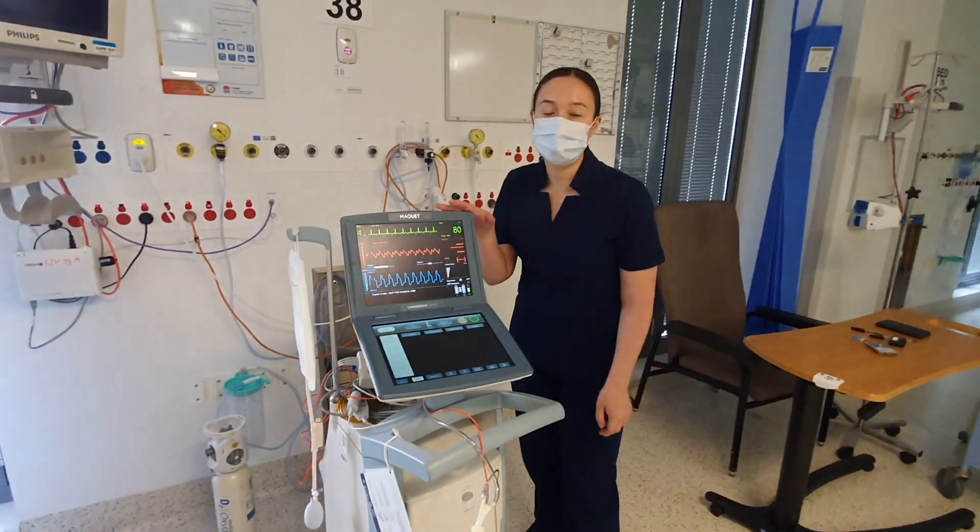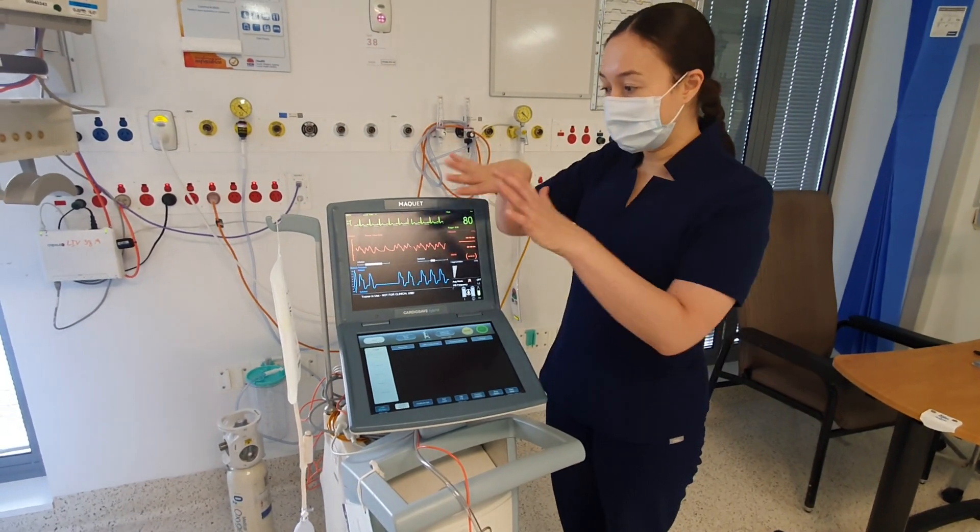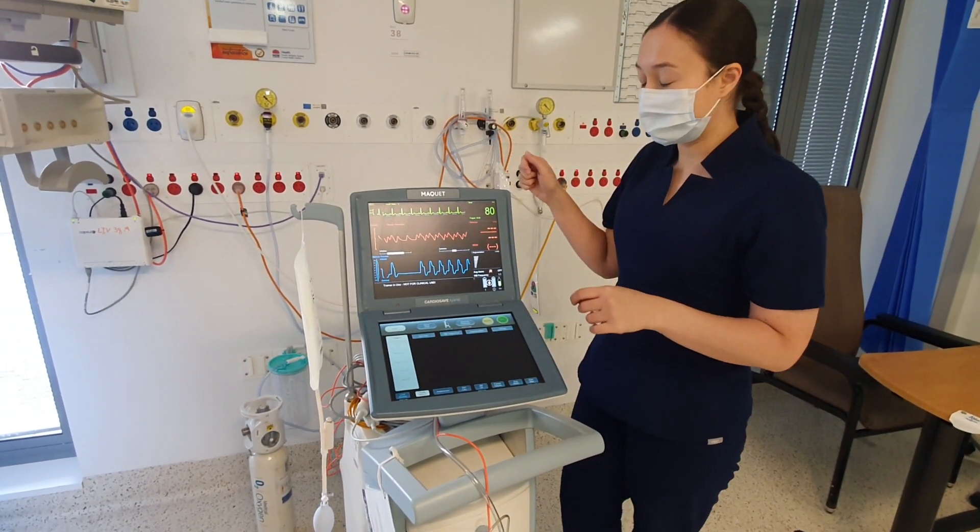Hi everyone, this is the intra-aortic balloon pump — the Cardiosave model. I'm going to go through a little bit of the console and give you an overview of the console.